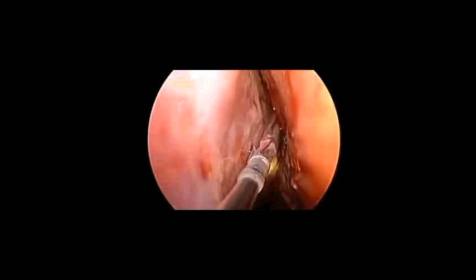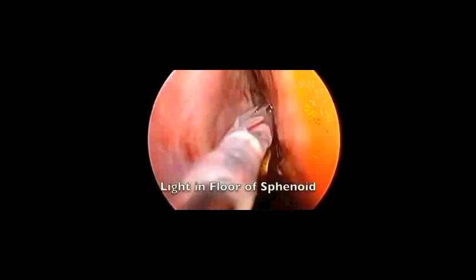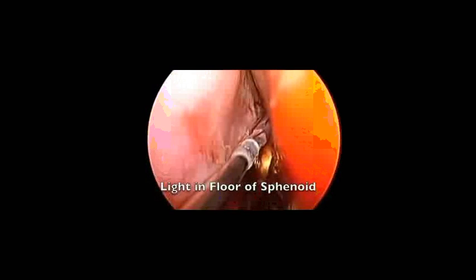The guide catheter is slightly moved back out of the way so the balloon catheter can be advanced through it. At this point, we're also going to see that the light guide is seen in the sphenoid along the floor. The balloon is now being advanced into the sphenoid. We see the light probe is on the floor of the sphenoid, indicating that we're in the right place.